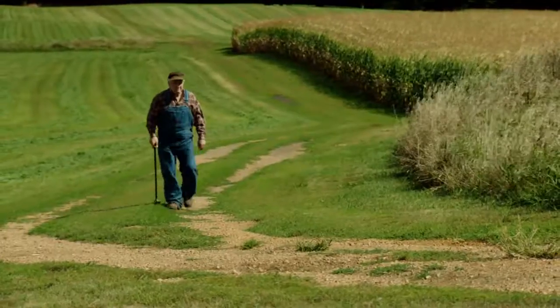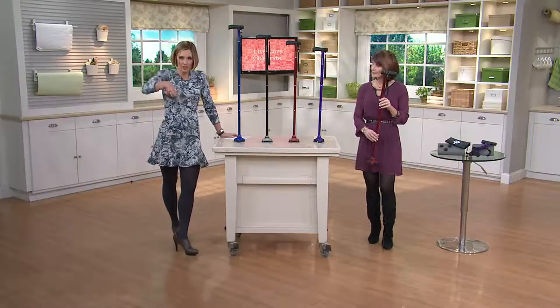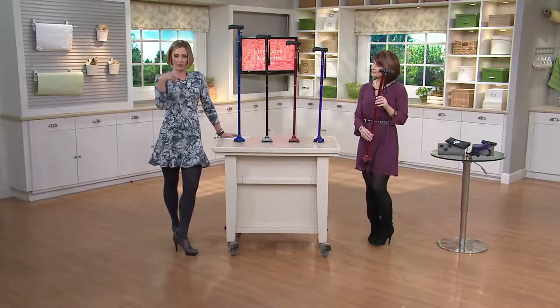Different than regular canes. First of all, it's a great sleek look and we've got some fun colors, but it mimics the human ankle because of the way it rotates. It's also easy to pick up if it falls down.